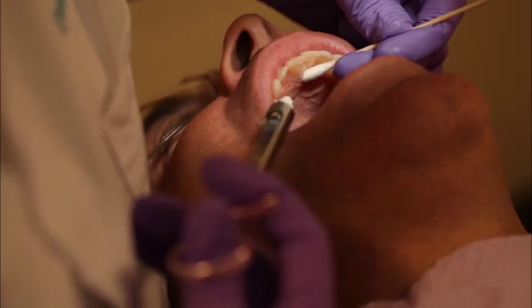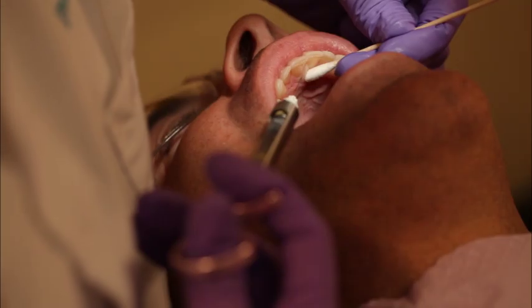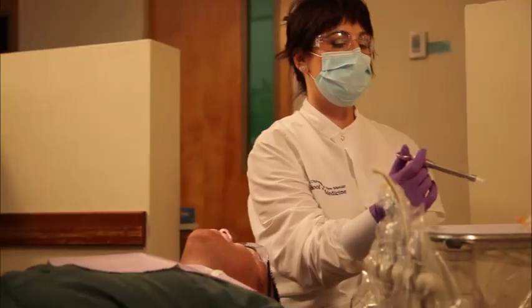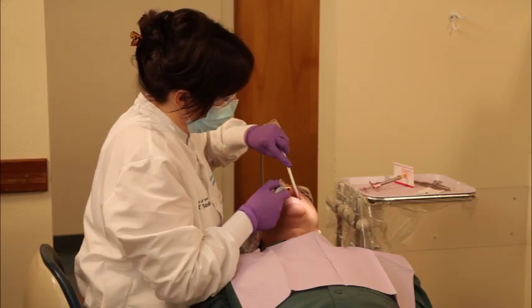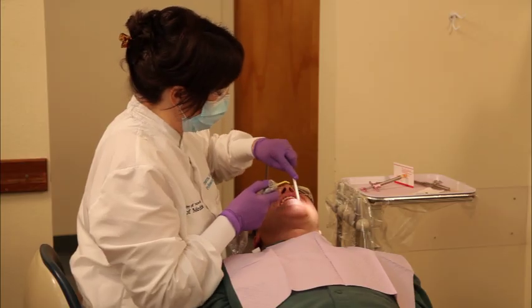If aspiration is negative, slowly deposit approximately 0.45 milliliters of solution, 1/4 of the cartridge, over approximately 20 to 30 seconds. Tissue in the area will blanch even further when the anesthetic is administered. Carefully withdraw the syringe and immediately recap the needle using the one-handed scoop method with a needle sheath prop or other recapping device. Rinse the patient's mouth and wait approximately 3 to 5 minutes until anesthesia takes effect before beginning treatment. Complications from this injection are rare.